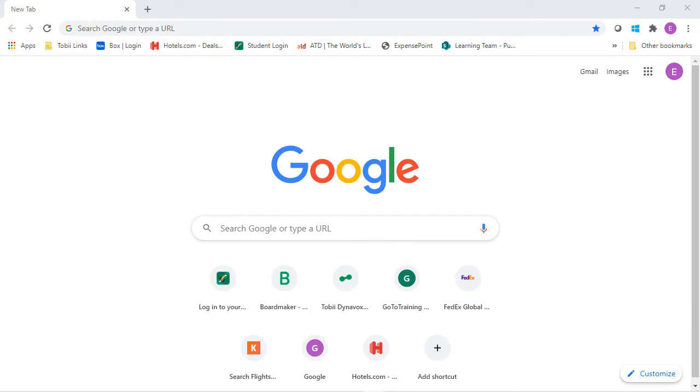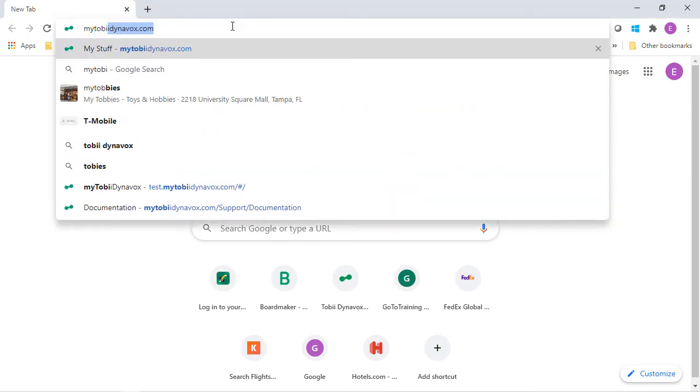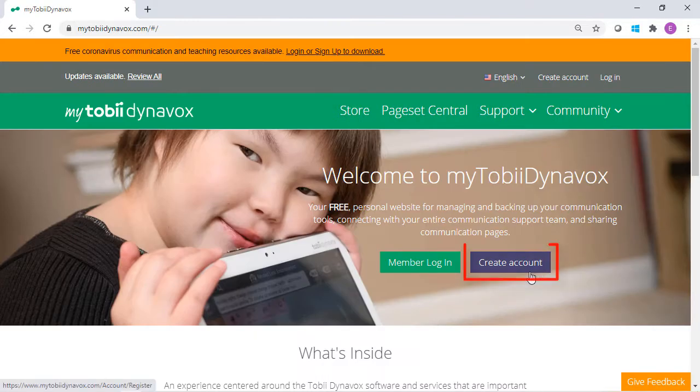Simply visit MyTobiDynavox.com, create an account, or log in to an existing account.